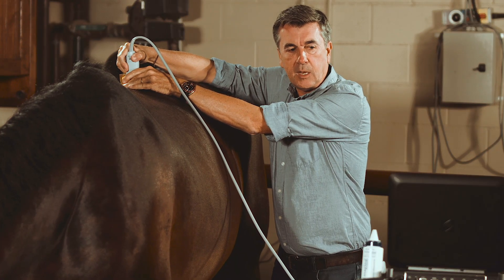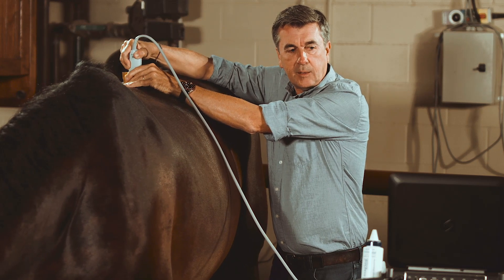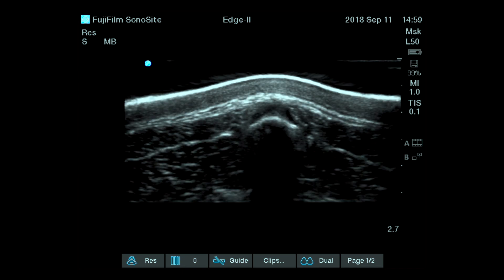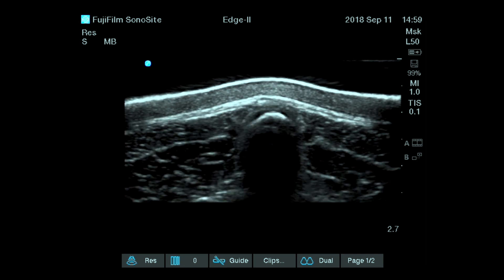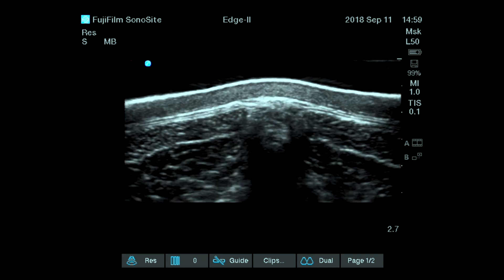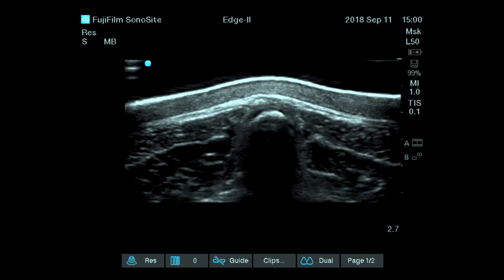At the level of the spinous process of the vertebra you are scanning, I am finding here just the small edge where we had a small irregularity. You can see that the bone is not exactly perfectly smooth, because we do have a minor change within the ligament and the spinous process insertion.